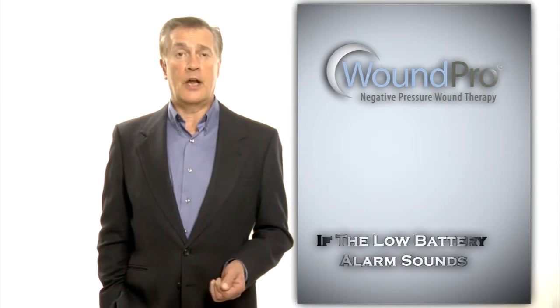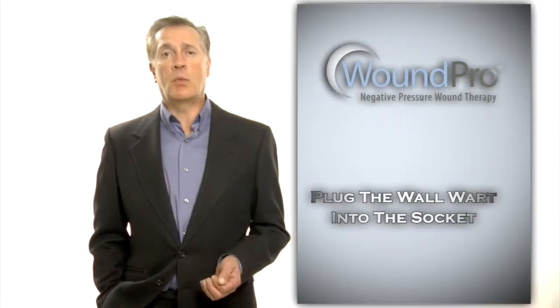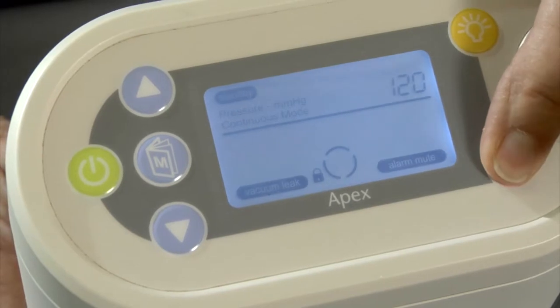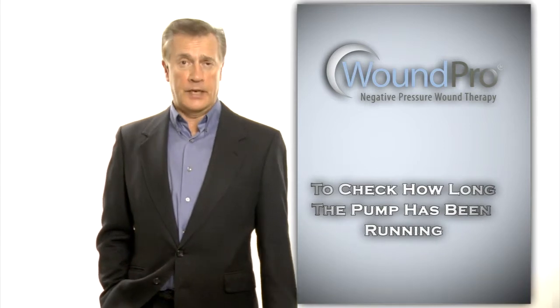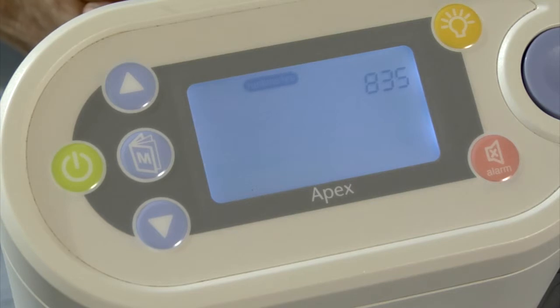If the low battery alarm sounds and displays the battery low symbol, plug the wall wart into an outlet as soon as possible. If you desire to mute the alarm, press and hold the alarm mute key. If you'd like to check how long the pump has been running, press the menu button while the unit is locked and in standby mode.